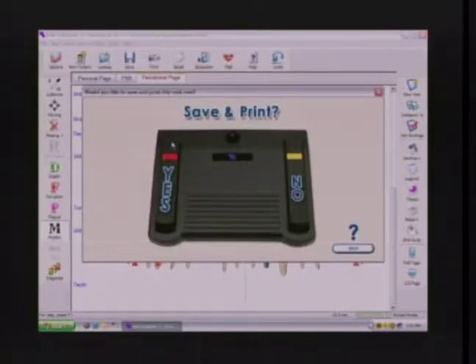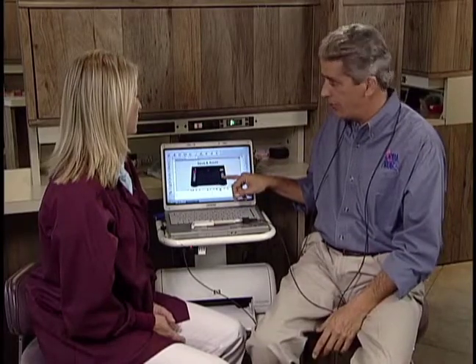Data collection complete. And we get a dialog box that says, do you want to save and print? I prefer to think of this as, is the exam complete? If the exam is complete, I want to save and print and I'm done, yes. If I'm not finished, let's say for example, I conducted that pocket depth, furcation, plaque, and mobility exam, but noticed that the patient had recession and it was turned off in the initial visit settings.